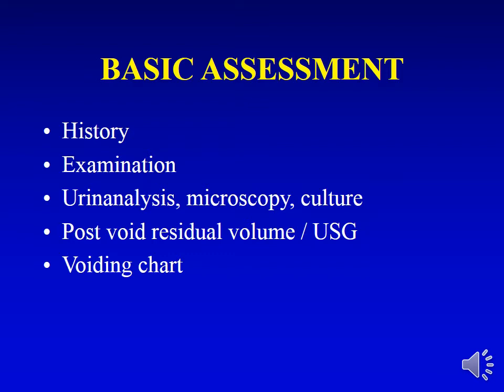We also need a voiding chart before any urodynamic. We give the patient a chart where they record how much they drink every day and how much urine is passed at different times of the day. Why? Because sometimes instead of just urinary frequency at night, for example nocturia, it may actually be nocturnal polyuria. It's not due to frequency alone, but due to excessive volume.